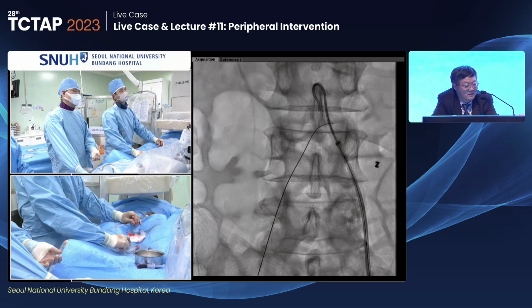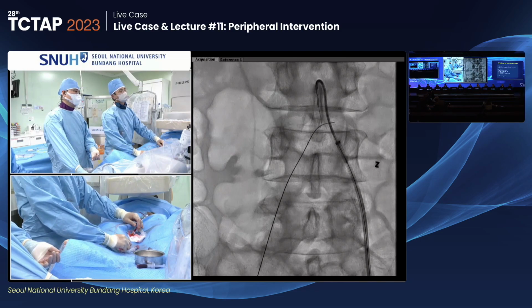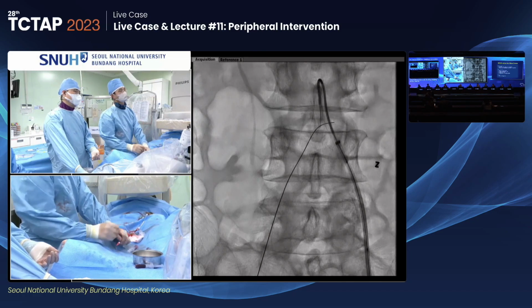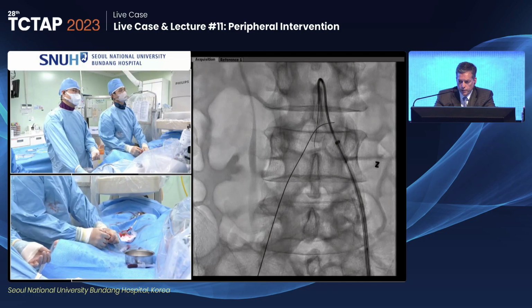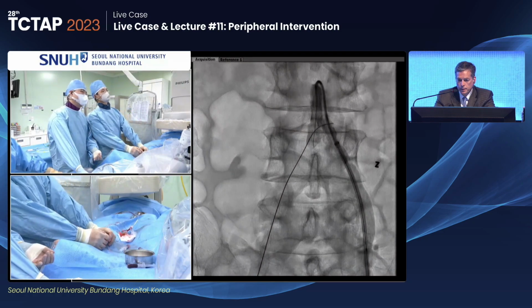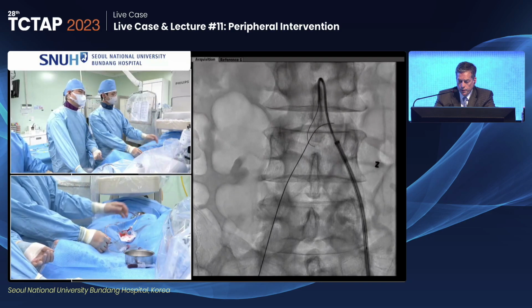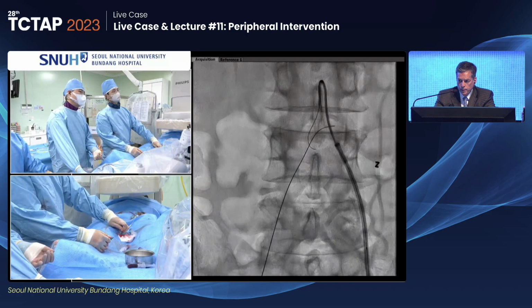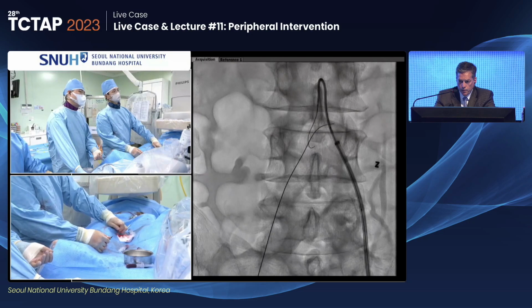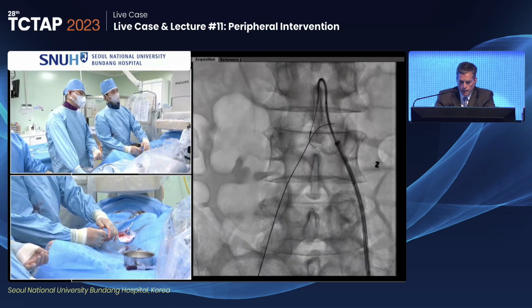Yeah, if that were to happen, as I think Dr. Laird pointed out, it is probably one of the most challenging ways to get your case done, because there's no easy way to save that at that point. I think you're occluding the aorta at that point, and then probably going off to the OR if they're in shock. Yes.